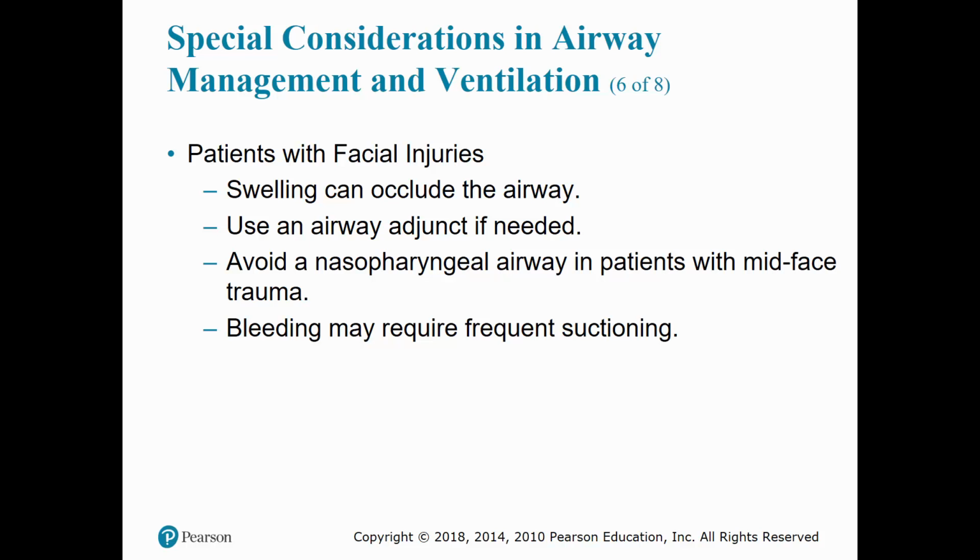Also, with patients that have mid-face trauma, due to the potential for injury to the sinuses and/or lower portion of the cranium, you should avoid insertion of a nasopharyngeal airway due to the risk of potentially inserting into that fracture and going either into the sinus cavity or into the cranium.